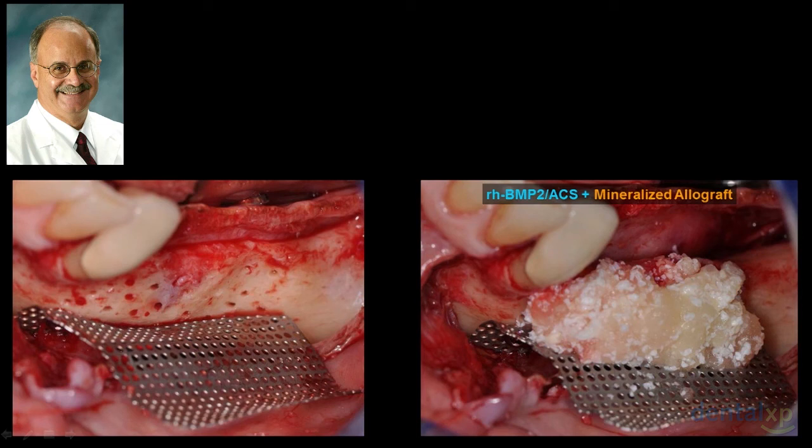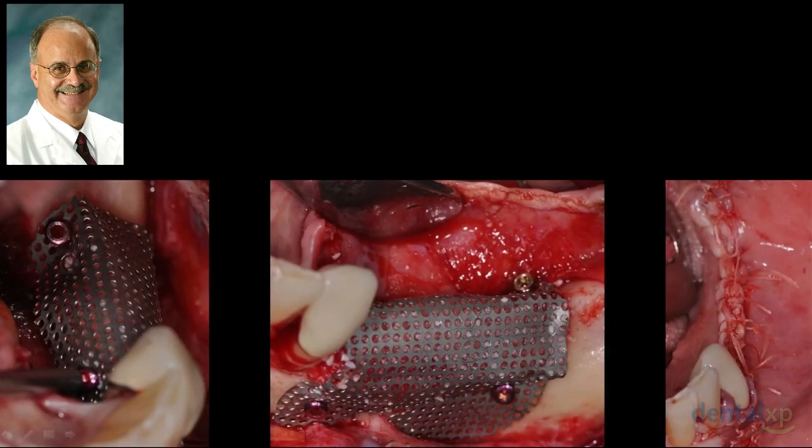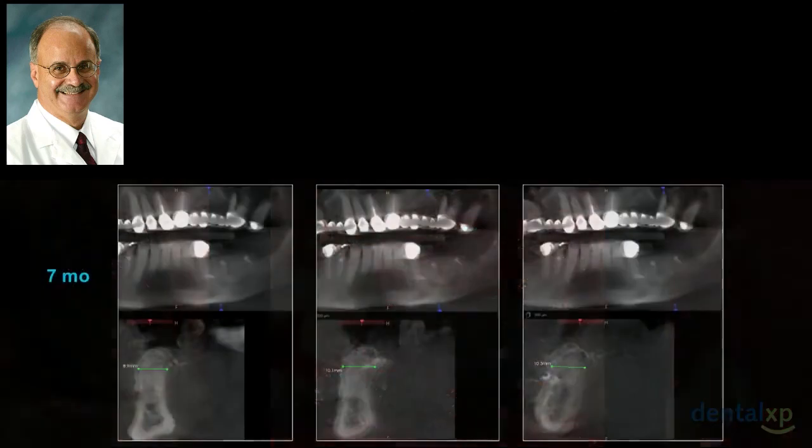The skill sets aren't so demanding, as opposed to, let's say, harvesting some autogenous bone specifically from that same ramus site. Most importantly, our incision design has to be appropriate, as it would be for any approach, whether it's GBR, block bone, etc. But we can do this in a predictable mode, even using PRGF as an adjunctive mitogen bioactive modifier, closing without tension, etc.